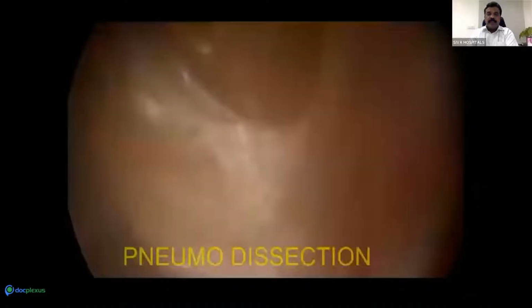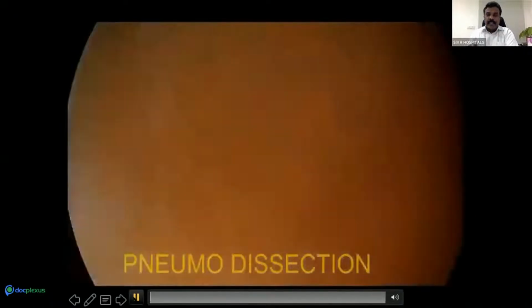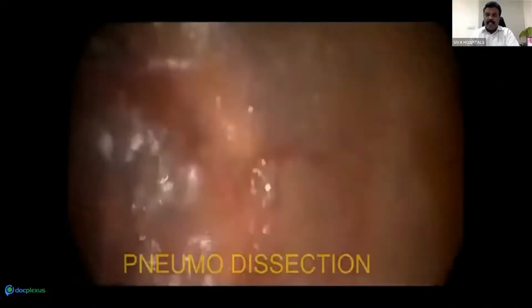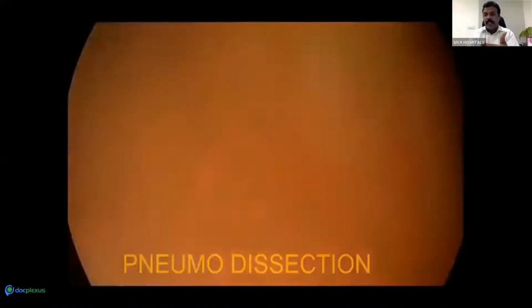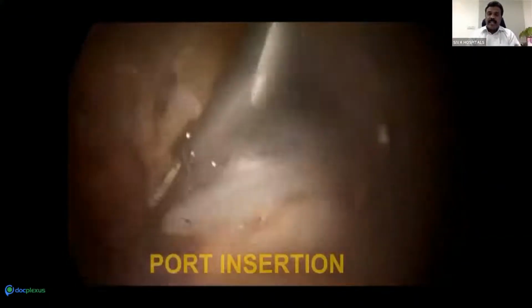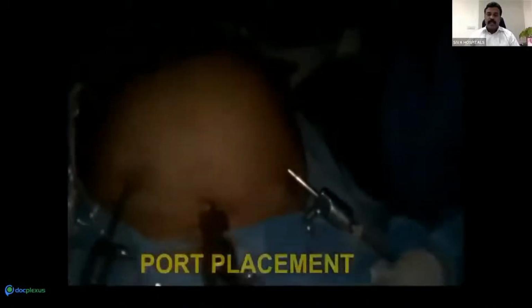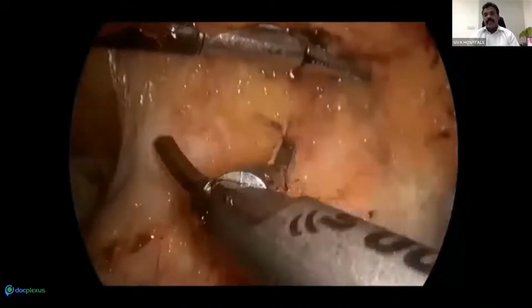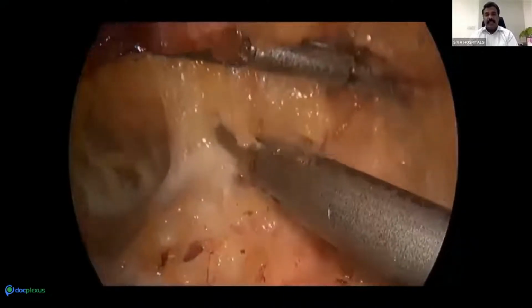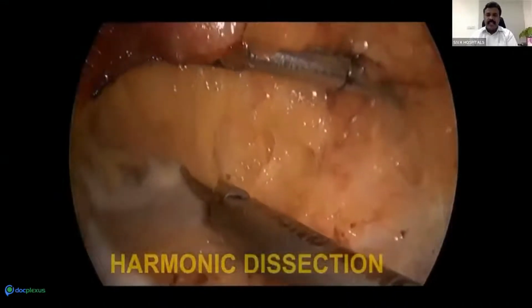Working ports. So straightaway I'll just go to the case scenario. This is a 10 mm port which I made supraumbilically, the dissection which is carried out initially by a 10 mm 0° scope in the subcutaneous plane between the fascias. Now after that you can introduce both the right iliac fossa and left iliac fossa 5 mm ports with a harmonic scalpel or bipolar or even the monopolar. We can dissect between the fascia here, Scarpa's fascia. So that is the bloodless field.